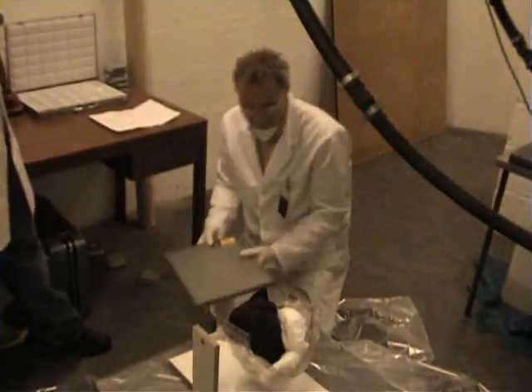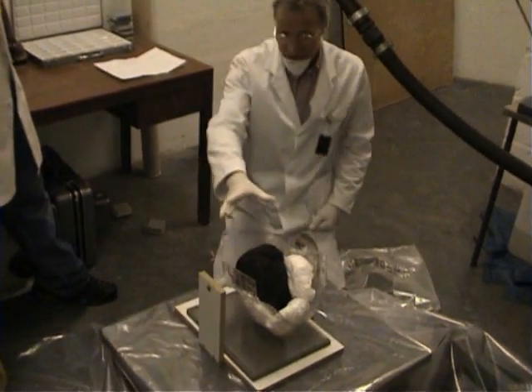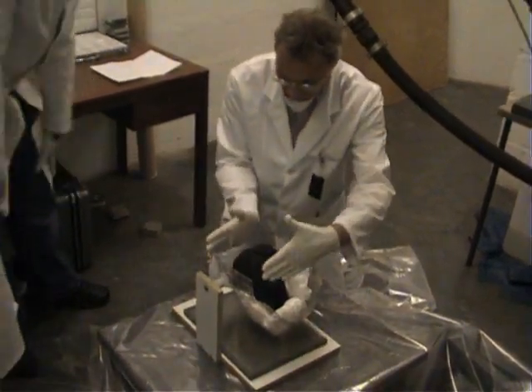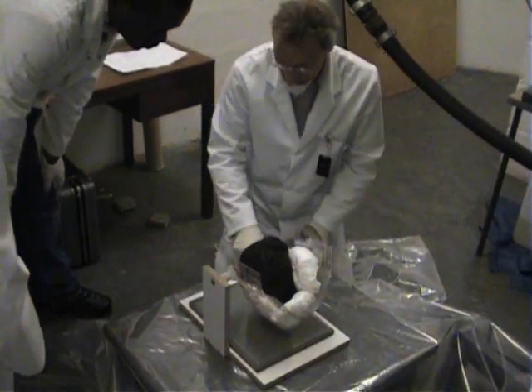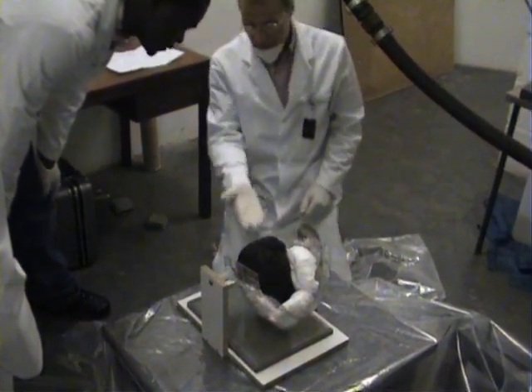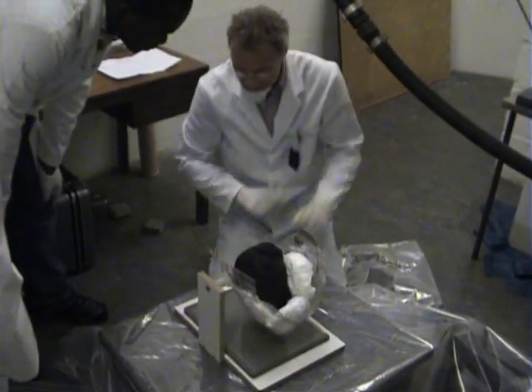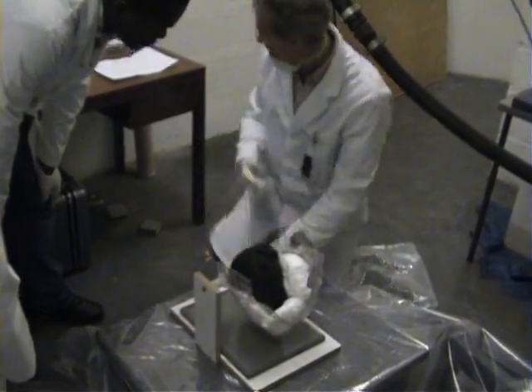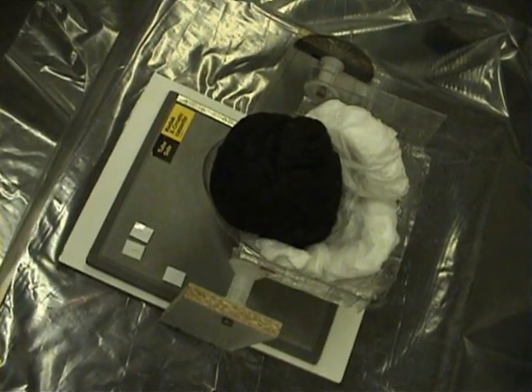So what we can do now is put the lights back on, and we can now start to set up the X-ray cassette. Having centred the X-ray beam up, I know that what we're interested in is recording this area. Each time we're going to aim to put this marker here up — as far as we're concerned, when we look at the film, this will be in the top left-hand corner of the film as you face it. So what we want to do now is have some anatomical markers, and then you'll be able to match the radiograph for what you've got on the list.